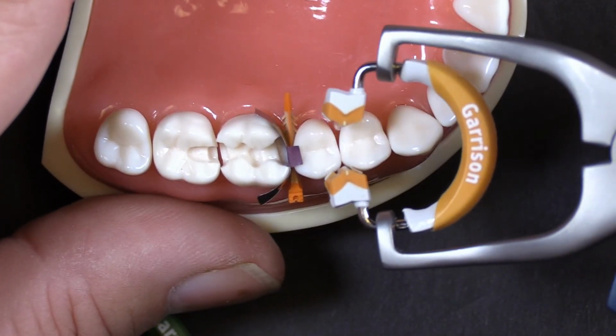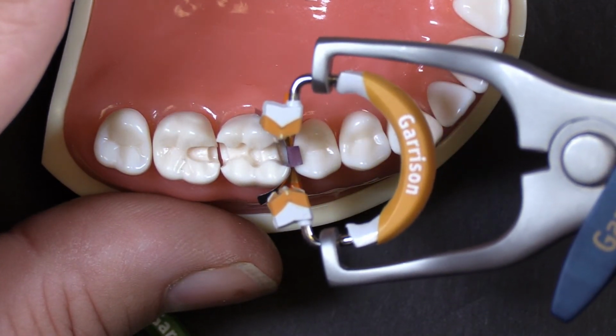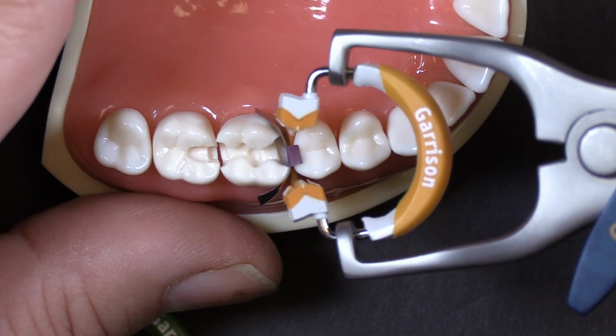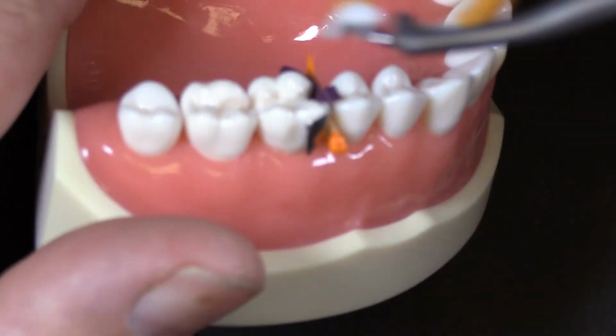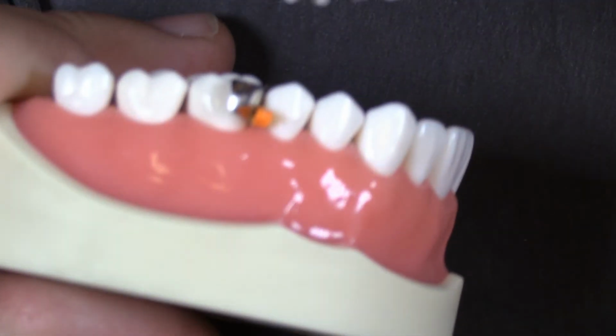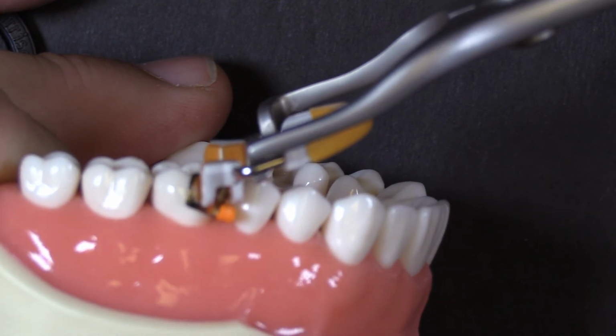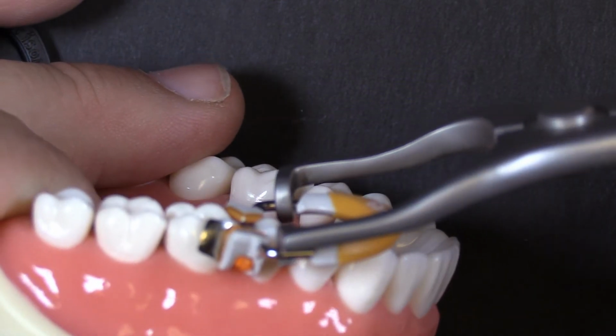So I'm going to show the occlusal view here. If I come in straight and try to push this straight down, I'm going to catch that band and squish it. You want to come in at an angle. Tip it up on the edge here. Come in at an angle, come into the band, and then rotate down into place.